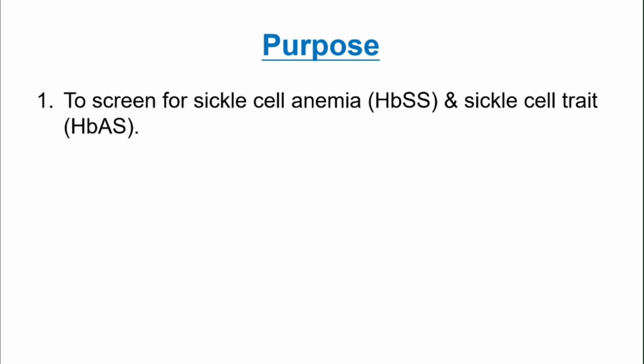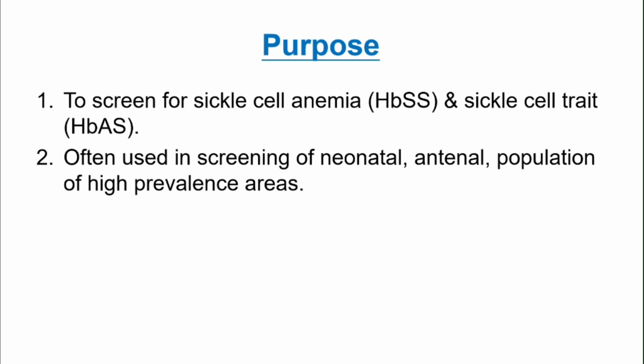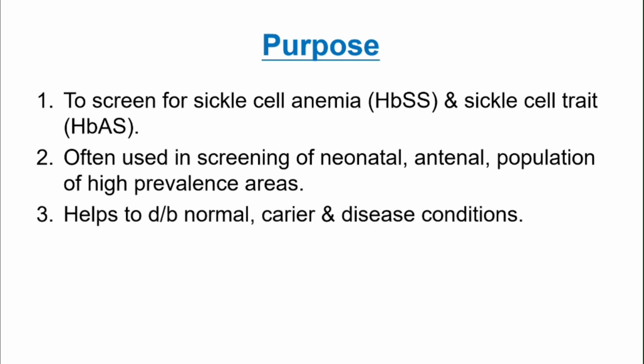Next we'll see the purpose. It is used for screening sickle cell anemia and sickling cell trait. It is commonly used for screening of neonatal, antenatal and population of high prevalence area. It also helps to differentiate between a normal person, a carrier, and conditions with disease.